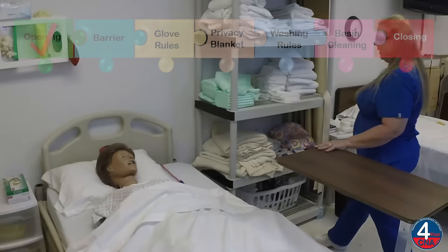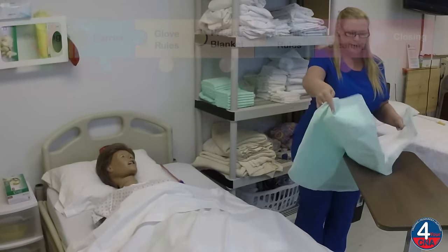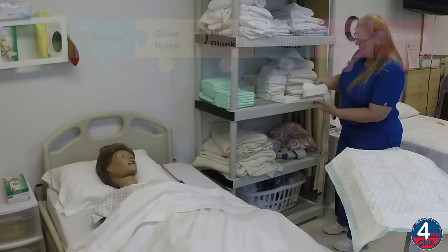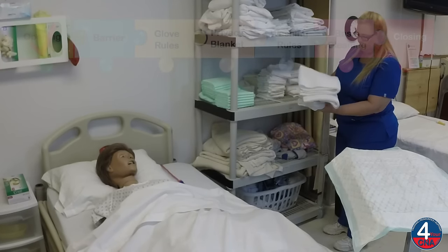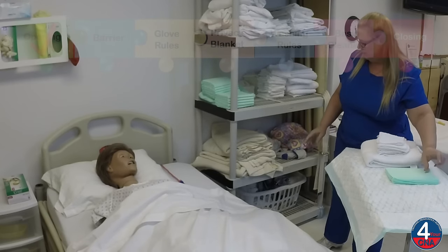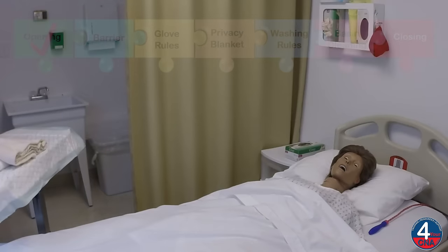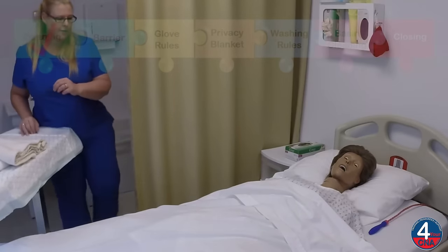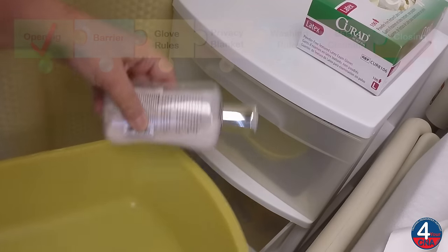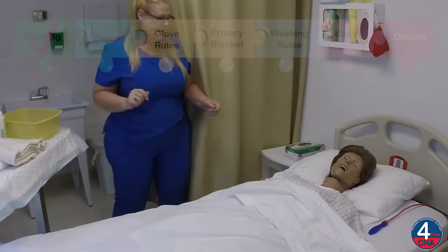Okay, Ms. Jones, I'm going to gather my supplies. I'll start out with a barrier that provides a clean place to put my supplies, and we're going to get four washcloths, a towel, a chucks, a privacy blanket, and now I'll gather my basin and soap, and a set of gloves.